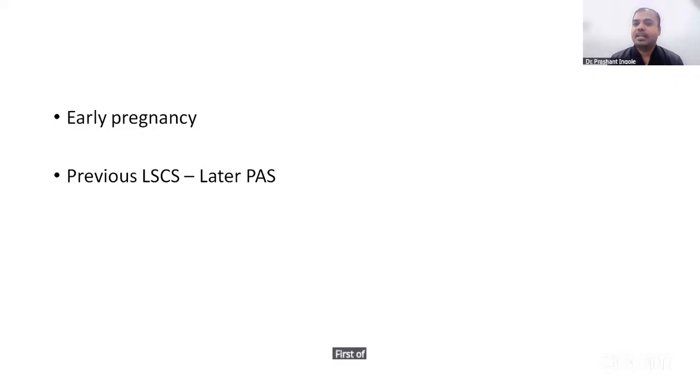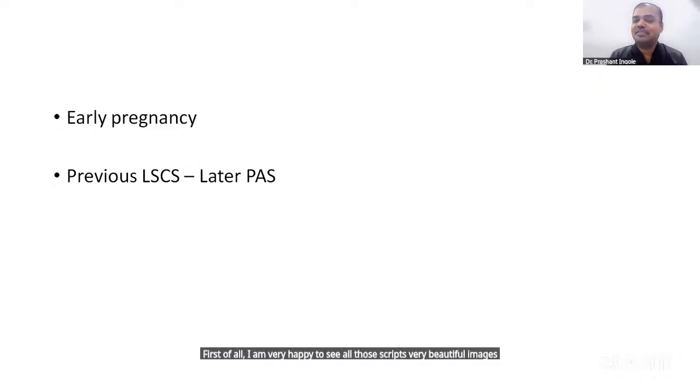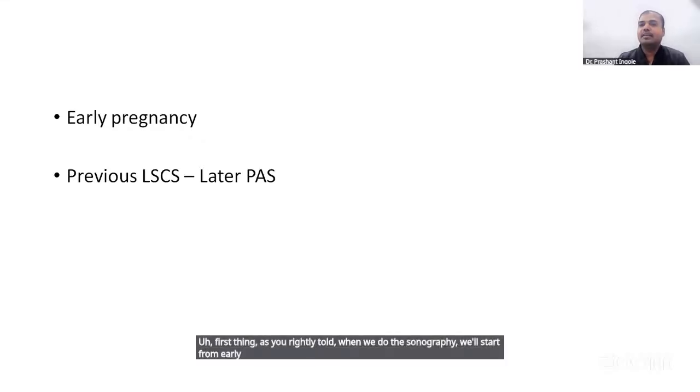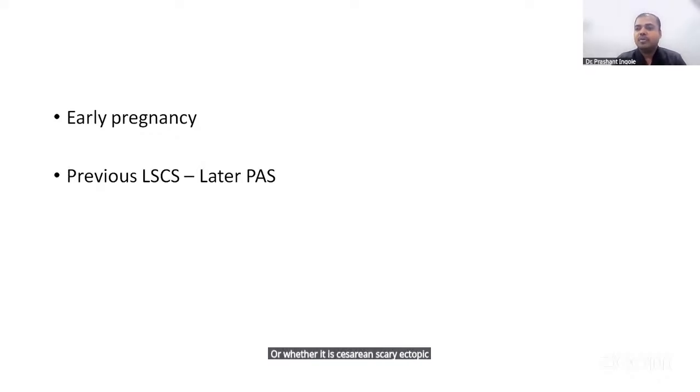First of all, I am very happy to see all those slides, very beautiful images that you have shared, sir. First thing, as you rightly told, when we do the sonography, we start from early pregnancy. In early pregnancy also we need to do a good transvaginal scan, and the sonologist or the radiologist who is doing the scan should tell us whether the pregnancy is a low-lying pregnancy, whether it is a cervical pregnancy, or whether it is a cesarean scar ectopic pregnancy.